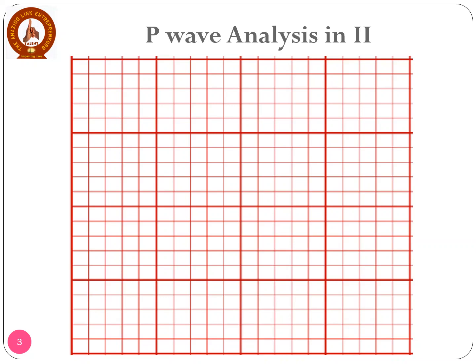Let's consider right atrial abnormality. It presents with peaking of the P wave and increased amplitude of the P wave.